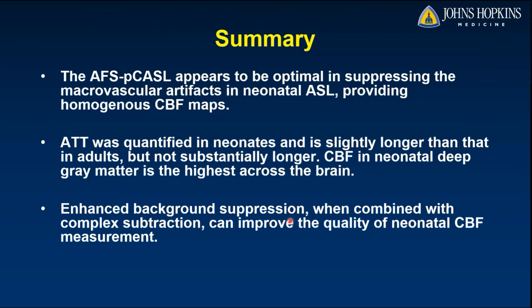We demonstrated that the enhanced background suppression, when combined with complex subtraction, can improve the quality of neonatal CBF measurement.